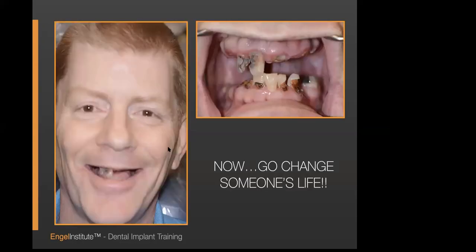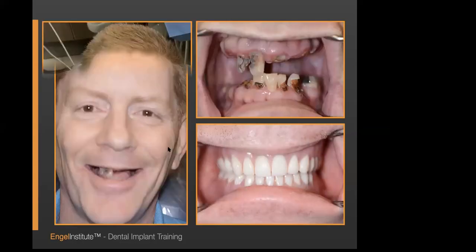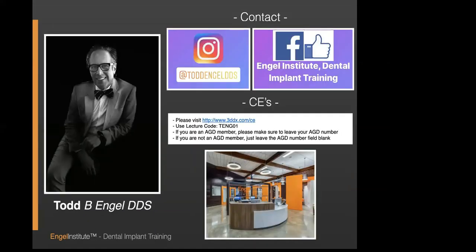And so here's Brent now, immediately after surgery.